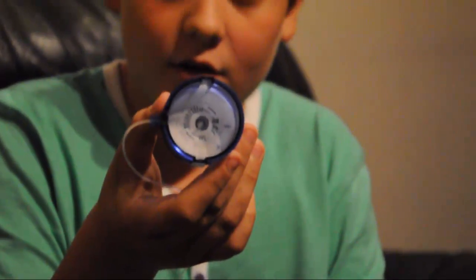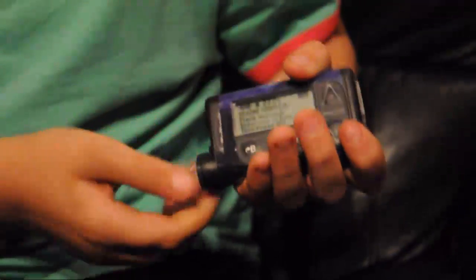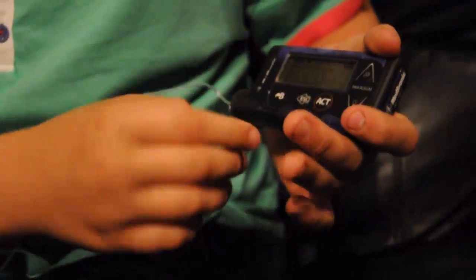And then the needle and the cannula are just inside. And now I'm ready to connect it to my body. Now I have to prime it, so I just get the reservoir, put that in, twist it, and then you'll feel it click in. Then it's saying that once it's locked in, I need to press act.